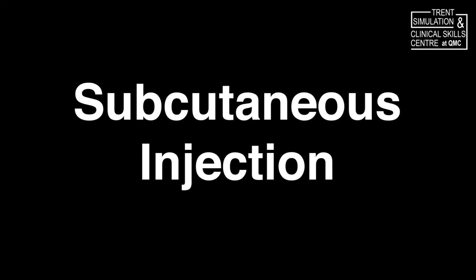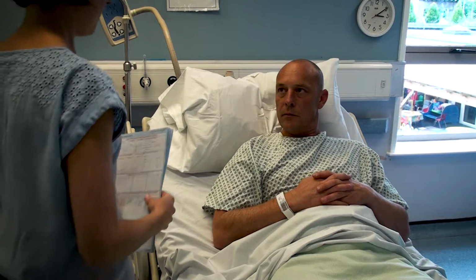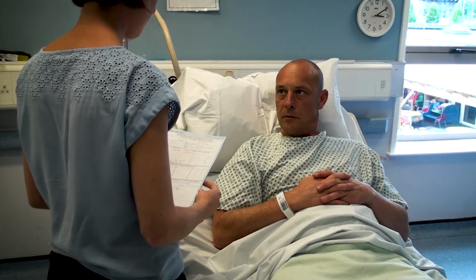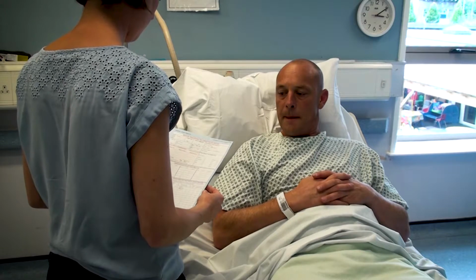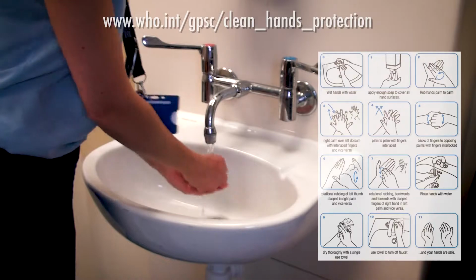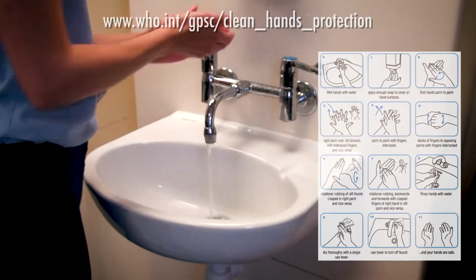Welcome to the clinical skills video for administering a subcutaneous injection. Prior to performing this procedure, you must explain to the patient what you're about to do, also inquiring about any history of adverse reactions or allergies to any drugs. You must ensure that you then wash your hands thoroughly using the 11-stage approach.